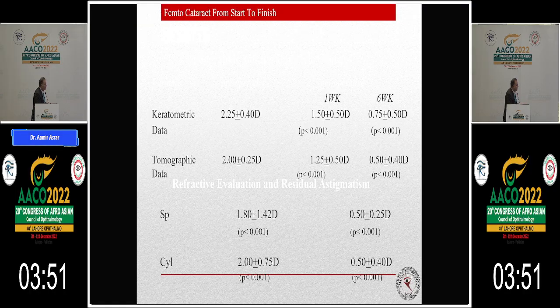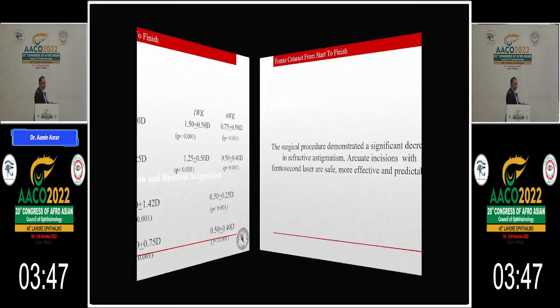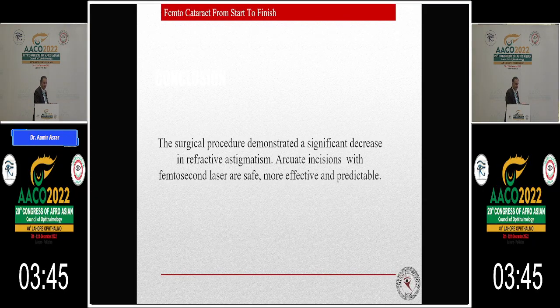of the cornea. Initially, we were not titrating our astigmatic incisions. Now, what we have started doing is to titrate our astigmatic incisions. What I mean is, initially what I used to do was to open up the astigmatic keratotomy on the table. Now I'm not opening them up on the table.